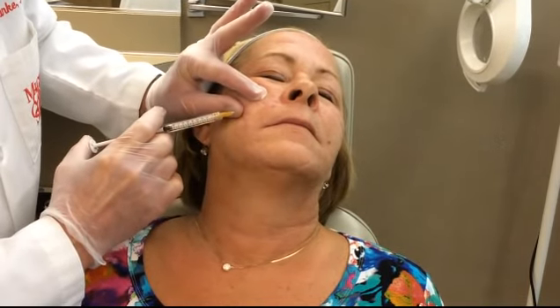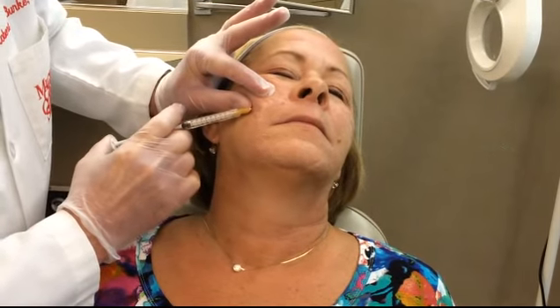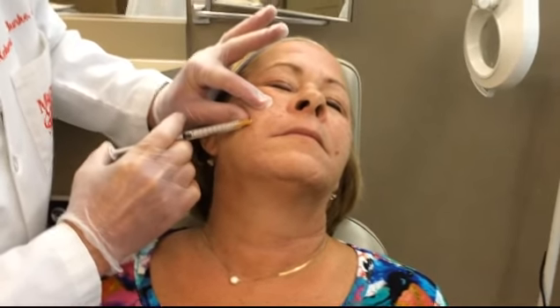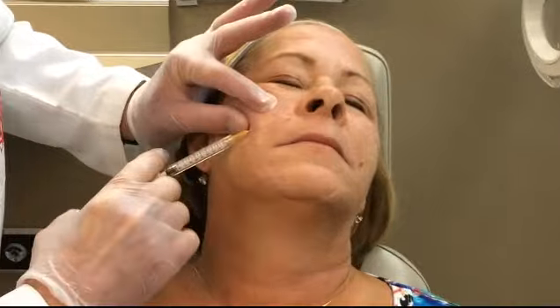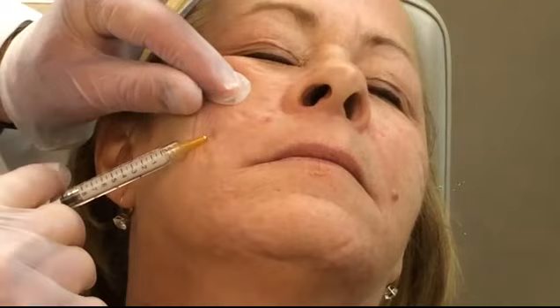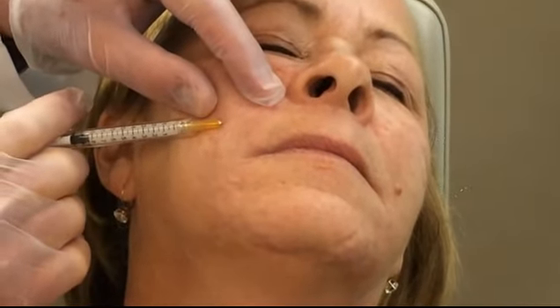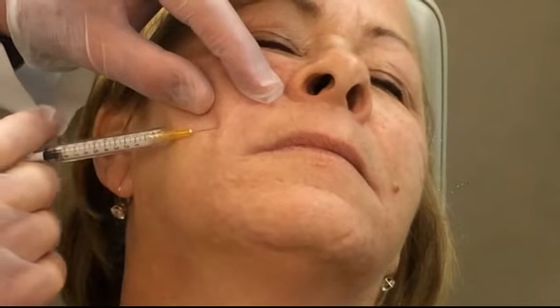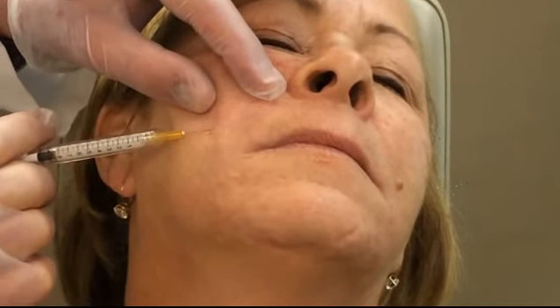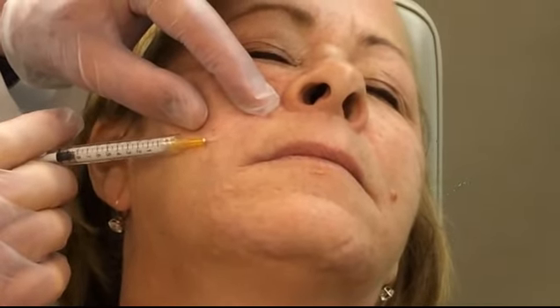It does what we call a sub-incision. I'm going to go right along underneath this, lift it up, and we're actually creating a little bit of space in here. This is a sub-incision, which many dermatologists do in order to gently lift up the scar. We're trying to lift it up and break up some of that scar which makes it depressed, so it's like a little valley between hills.